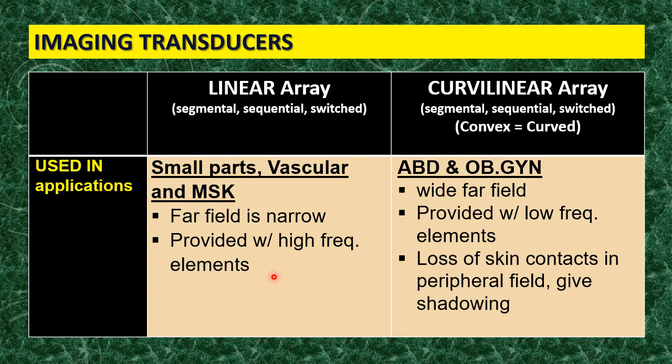Why? Because I don't need deeper. Okay, I'm not scanning deeper, I'm scanning shallower. That's why it's provided with high frequency elements, right? So it's used for small parts or vascular, and sometimes it's in the MSK, musculoskeletal, also.